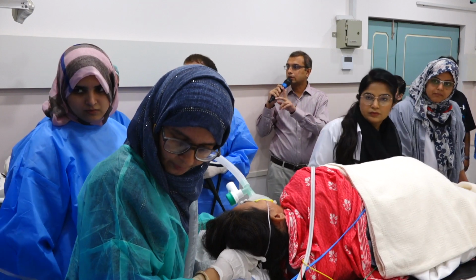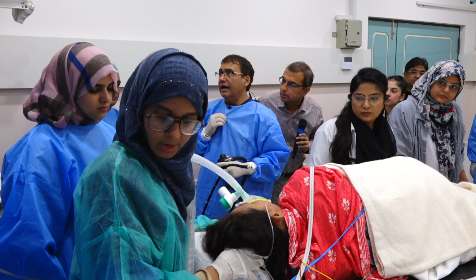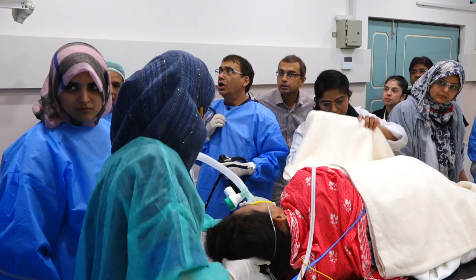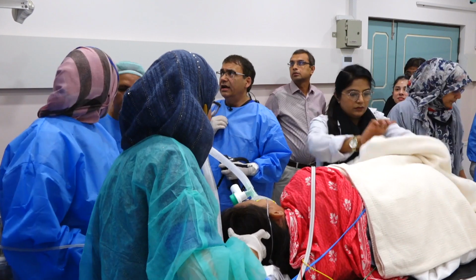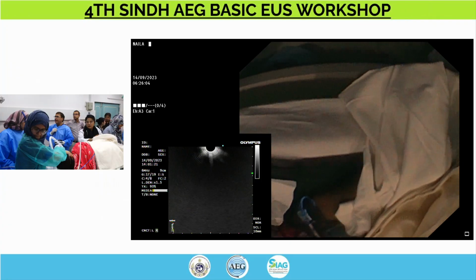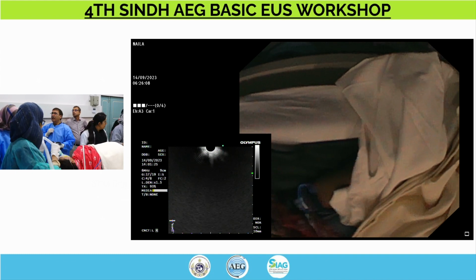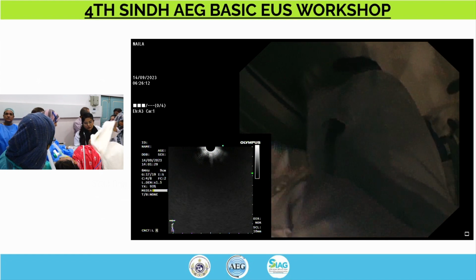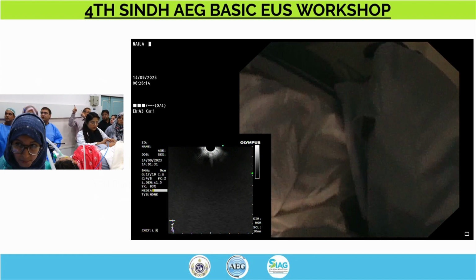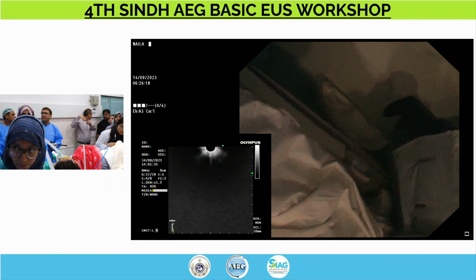The views. Can you hear Khalid bhai? Can you, Kambis, can you hear me? Loud and clear. Okay, I think we have a camera view, I see that there, and we will have a EUS and endoscope view on the other one. Can you do both separately? Separately. Are you ready there to start? No, not yet. Not yet. Okay.